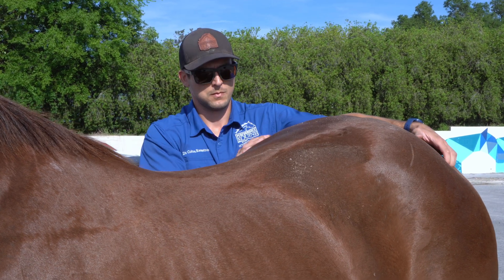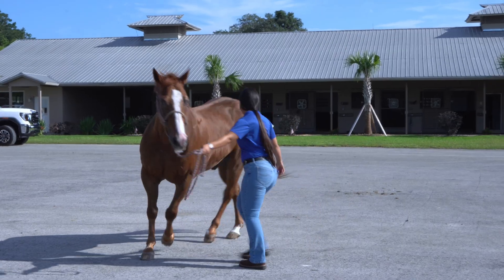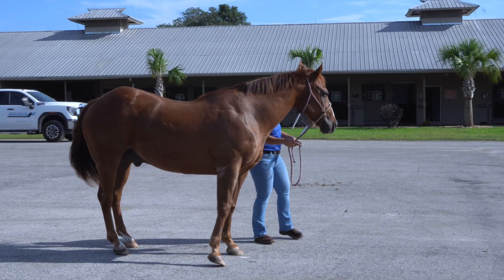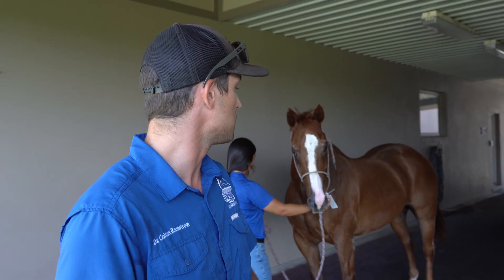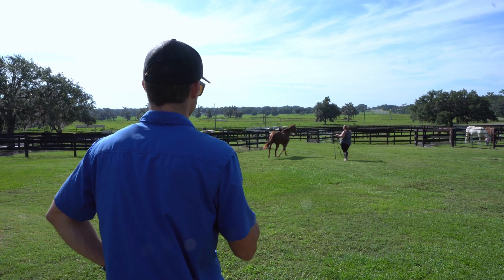So far we've been watching Big Mac move around a little bit — straight line at a walk, trot, figure eights at a walk — looking for any asymmetries, any signs of pain or any sort of issue somewhere that might lend us to target in on a specific area, do some more diagnostics, maybe block, maybe imaging.